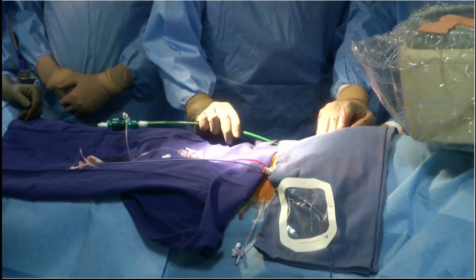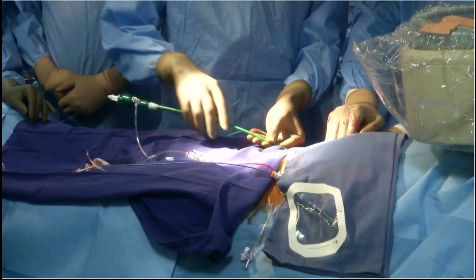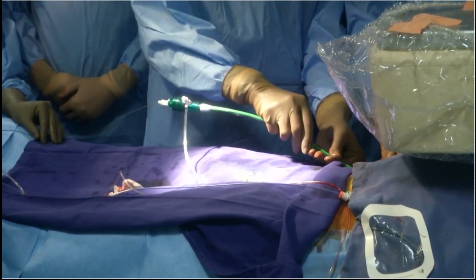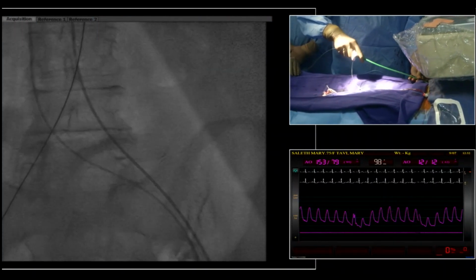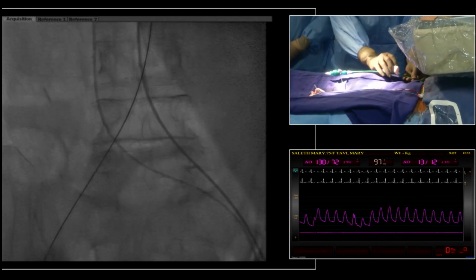Change the stiff wire. So you also pointed at a very important point: the sheath should be advanced over the stiff wire, not over a normal wire. Show down, please, nicely. So did you use the dilators going inside prior to this sheath? What was your sequence?